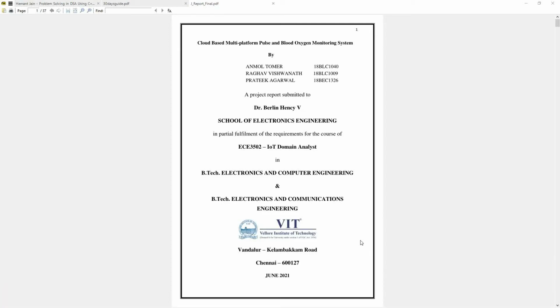Hi, I am Anmol and I am presenting the demo for our project. The title of this project is Cloud-Based Multi-Platform Pulse and Blood Oxygen Monitoring System.